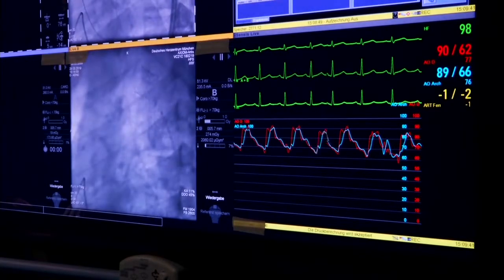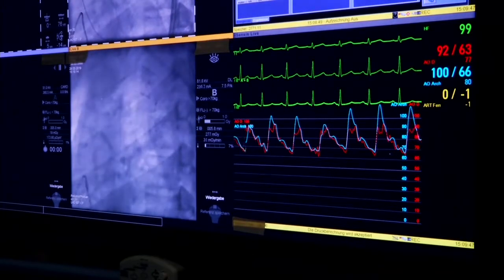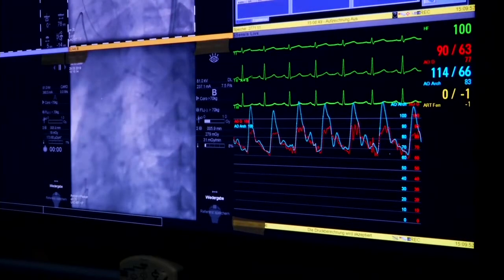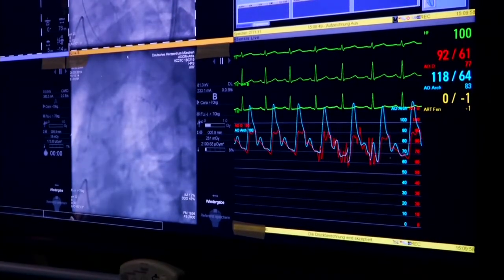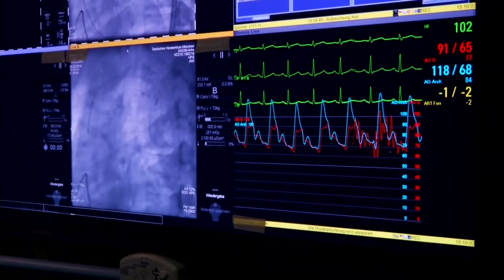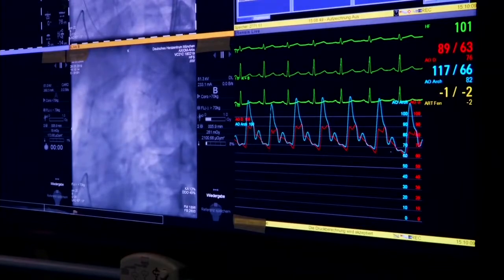That's what I noticed, that there was a kink at the proximal part of the first stent, and that's why I suggested that you could have ballooned it on your way out. I understood, yeah. But I don't think the superior part of the aorta is covered by stent in that area. I'm not quite sure that we get it ballooned with a balloon.